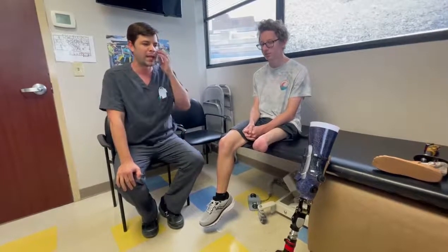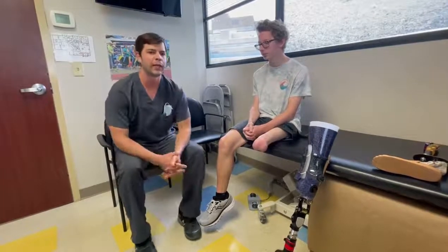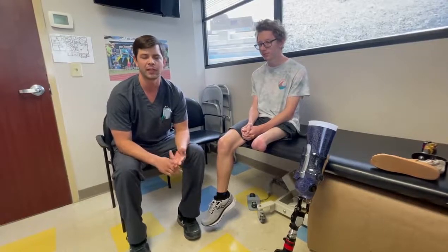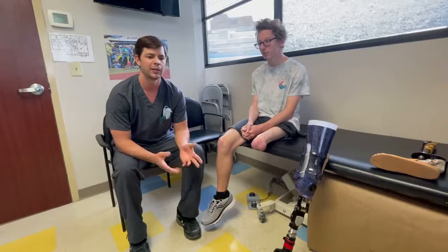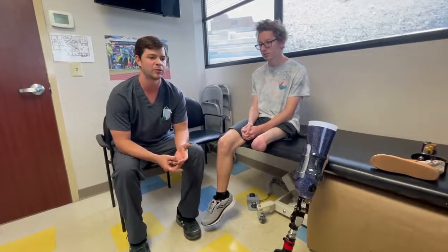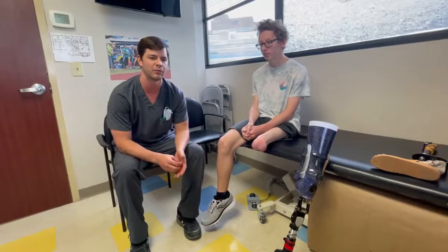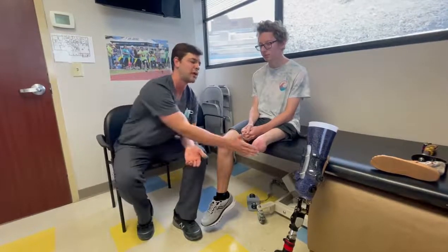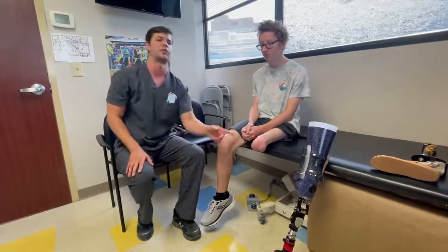Last time I saw him was in 2018. He came to us from another provider wearing a gel liner with a lanyard strap, and he had a lot of issues with dermatitis and folliculitis, which happens a lot with liners. The hygiene challenges of liners combined with the lanyard suspension system created a lot of pistoning for him.